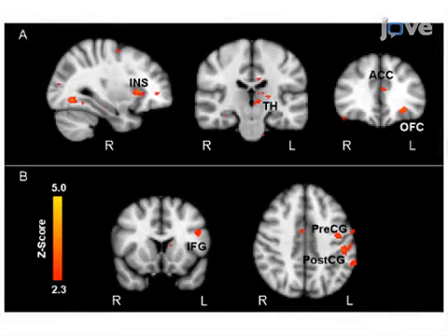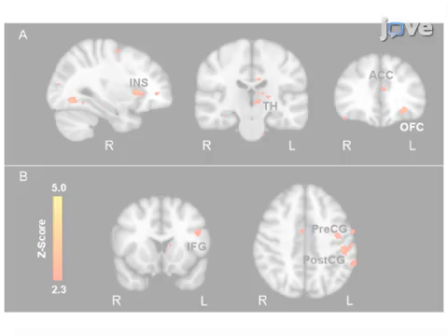Ultimately, functional imaging during the emotional oddball task in schizophrenia first-degree relatives is used to show decreased activation in fronto-striatal circuitry in response to target stimuli in at-risk children and adolescents. The main advantage of this technique is that it allows for non-invasive imaging of the brains of children and adolescents while they are engaged in cognitive functions.